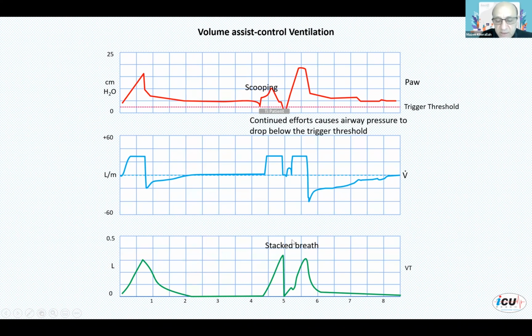The reason why you don't see it stacked here in some ventilators, as we talked about in the air leak session last week or the week before, is that the ventilator will recalibrate. This is a recalibration to the zero line. That's why it's vertical. And this volume is actually added to this volume. So what you see inside the lungs would be 300 plus 300, that's close, total of 600.